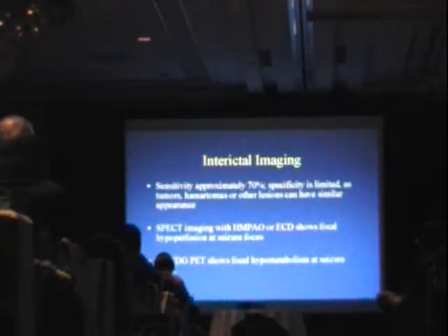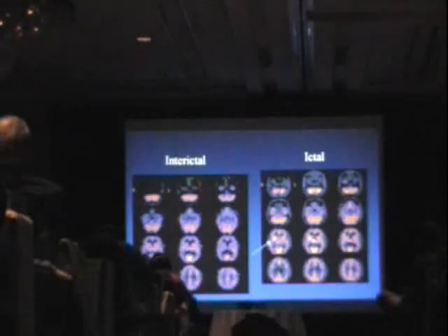For this, you can use either PET imaging or SPECT imaging. And this is actually an approved indication. You can get reimbursed for PET imaging for these patients. But you're doing an interictal scan, and you're looking for hypometabolism or hypoperfusion on either scan.